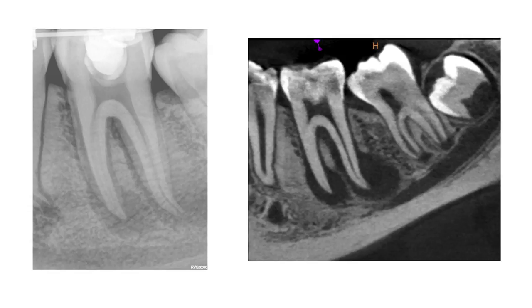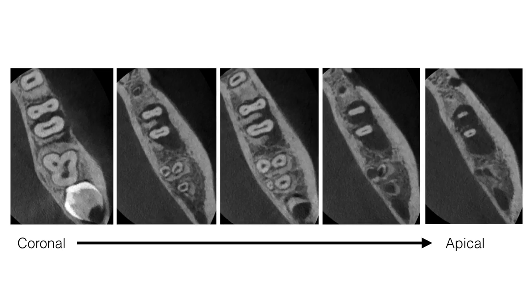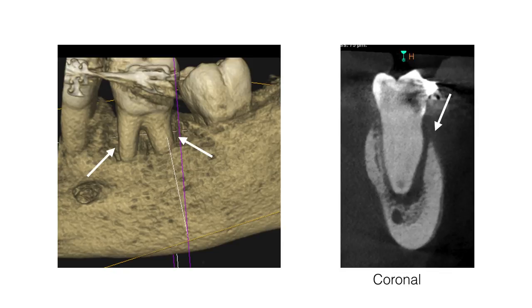A sagittal view of the CBCT scan demonstrated two large periapical radiolucencies around the mesial and distal roots, with the distal area extending right up into the furcation. This slide shows different slices of the CBCT scan through the axial plane, emphasizing the extent of the periapical pathology. A 3D reconstructed view and a coronal view also clearly illustrated the loss of the buccal bone plate, exposing the coronal two-thirds of the mesial and distal roots.